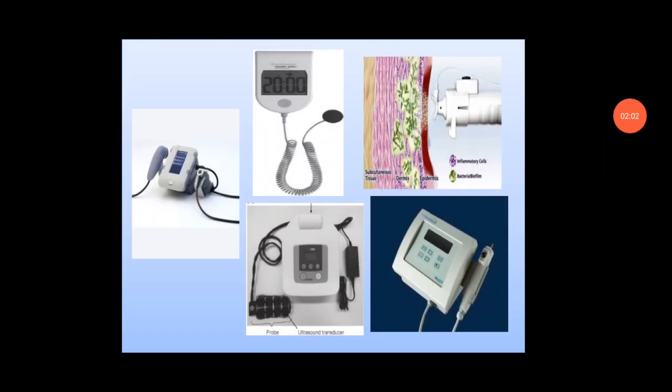Coming to the first type of ultrasound, that is conventional ultrasound, which is the oldest and most conventional therapeutic type of ultrasound. This first picture is conventional ultrasound. It will be delivered at low or high frequency. Intensity is using pulsed or continuous delivery mode. Application with a contact or non-contact. We will use aquasonic gel or tap water as a coupling agent. It is mainly used for thermomechanical effects on ligament, muscle, and tendon disorders.